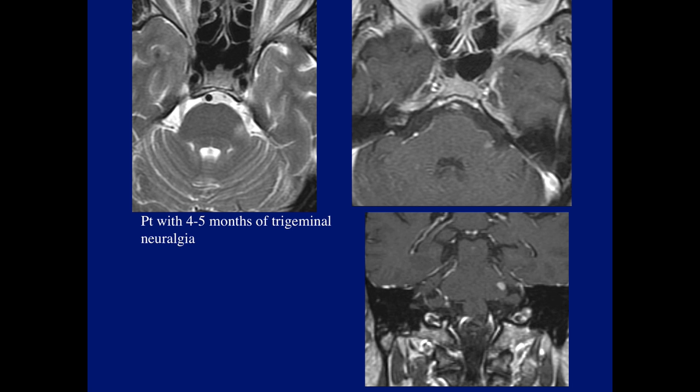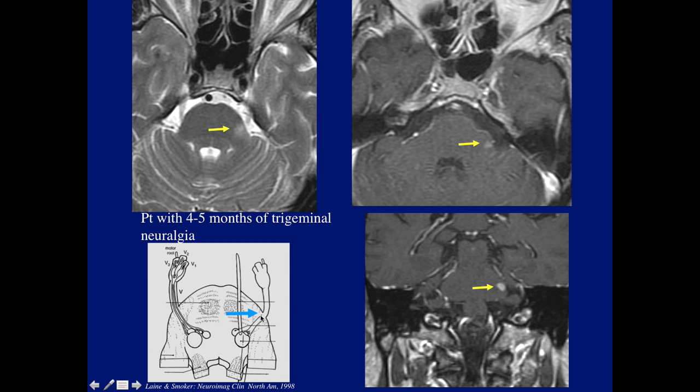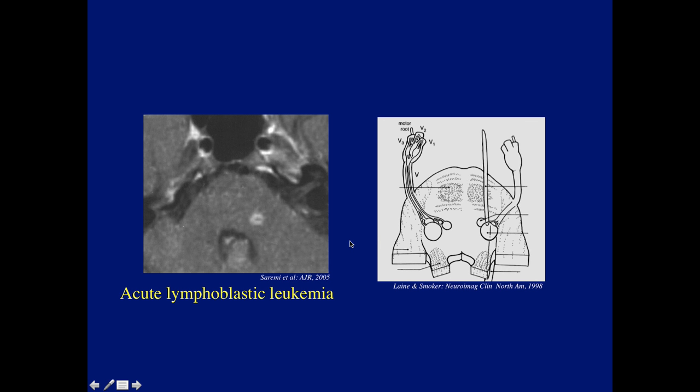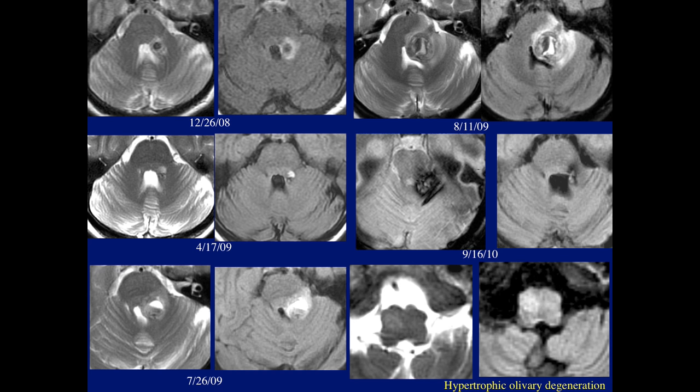Here's another patient who had four or five months of trigeminal neuralgia — again, notice the lesion in the region of the root entry zone of the trigeminal nerve. And here's a patient who had acute lymphocytic leukemia, again with involvement of the trigeminal nucleus region in the pons.